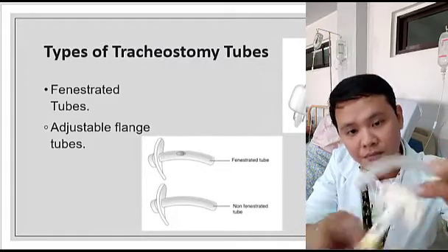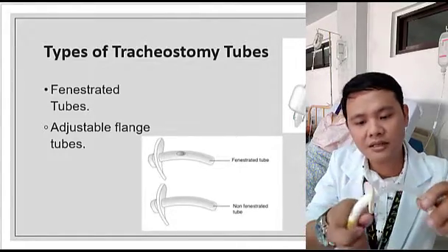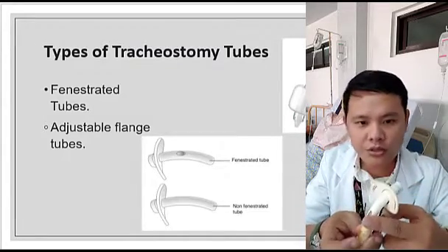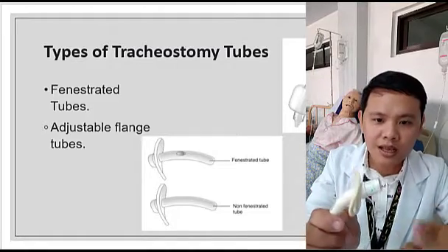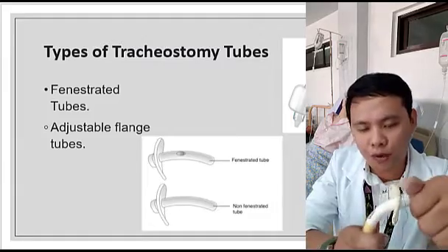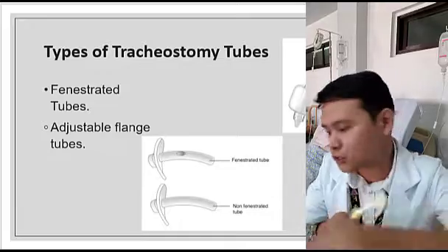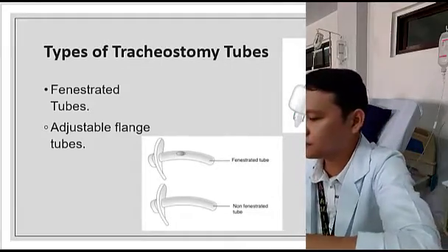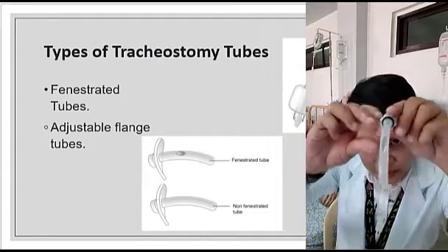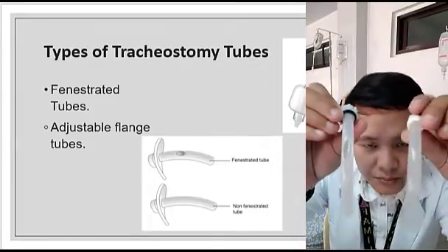Okay, wala siyang butas dito. So meaning to say, ang pasyente natin, directly dito siya mag-inhale and exhale. Okay, so pag nilagay ko po ito dito, okay, malalaki yung fenestration, yung hole. So ang client natin is, dito na po siya mag-breathe in and breathe out. Okay, kapag ang client natin wanted to practice na yung paghinga or sa tingin niya kaya na niya, papalitan na po natin itong inner tube, papalitan na natin siya nitong tube na to. But as you can see here in this picture, or should I say in this video, okay, the difference nung tube kanina.